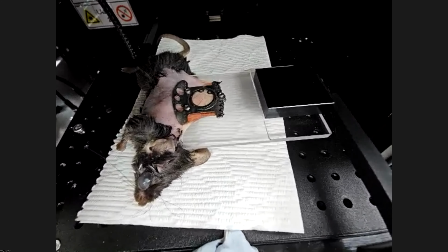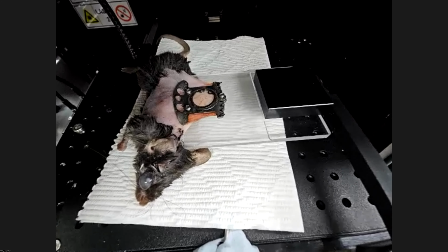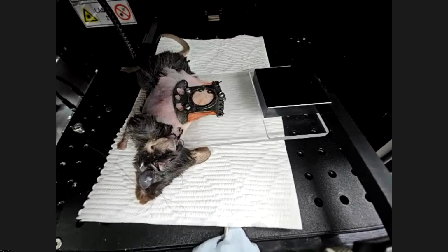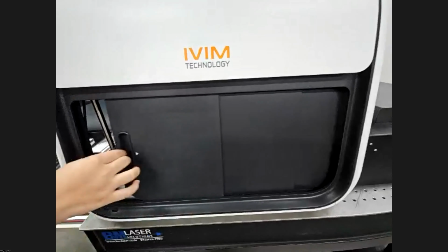Then the dorsal skinfold chamber implanted mouse model was mounted on the holder for long-term imaging, as you can see on the screen. So, to start the imaging, I will slide the animal stage inside and close the door.